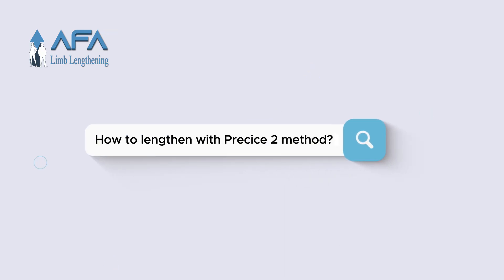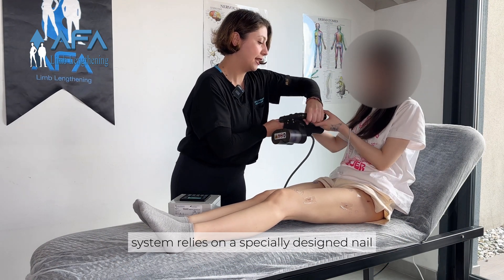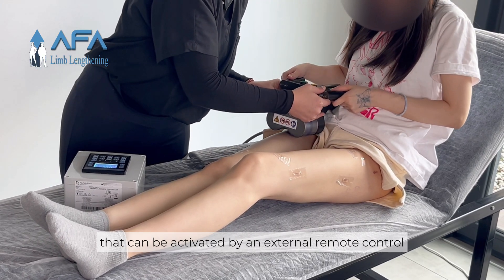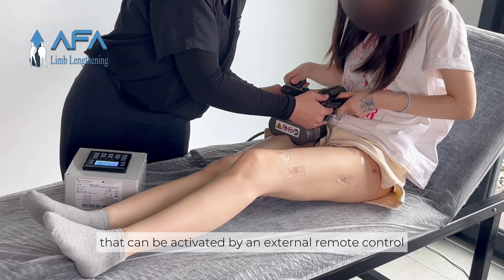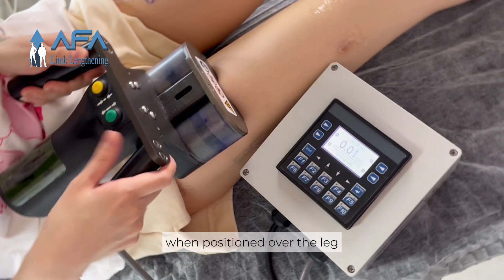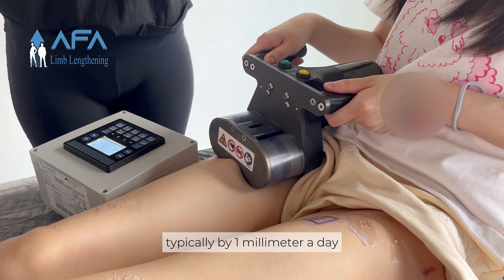How to lengthen with the PRECICE 2 method: the PRECICE 2 system relies on a specially designed nail implanted into the bone. This nail contains an internal motor that can be activated by an external remote control. Each day, the remote control device, when positioned over the leg, triggers the motor to lengthen the nail gradually, typically by 1 mm a day.